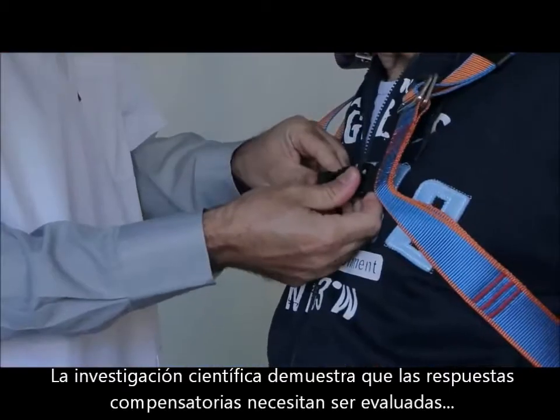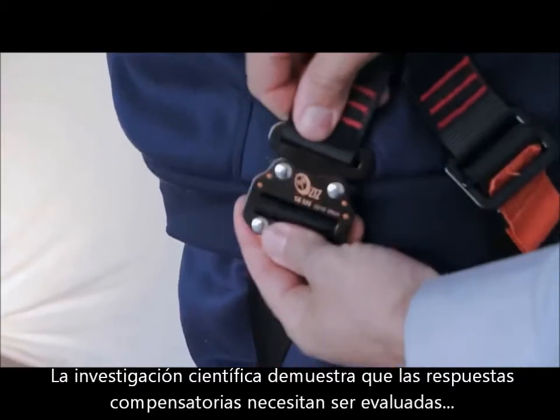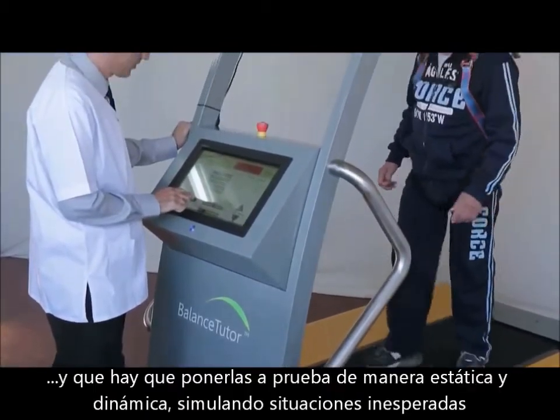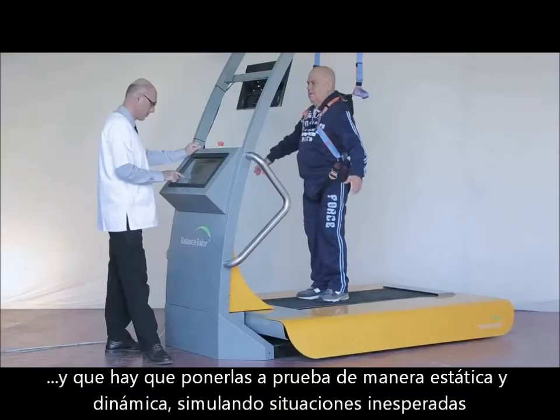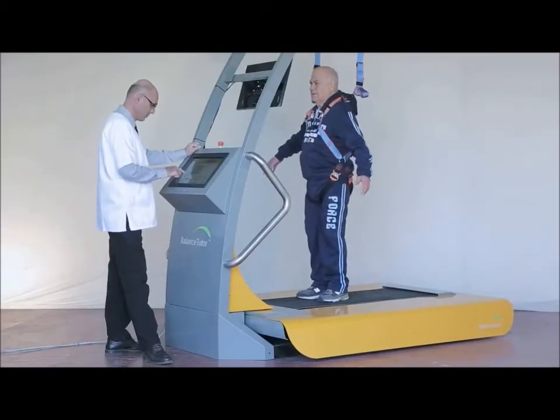Scientific research shows that compensatory response needs to be specifically evaluated and practiced in both the static and dynamic mode using unexpected perturbation.